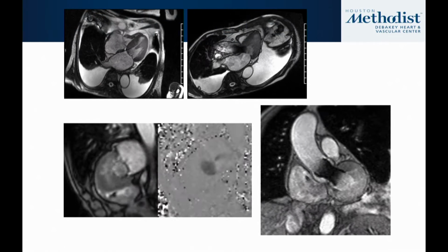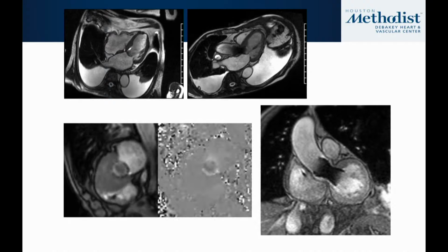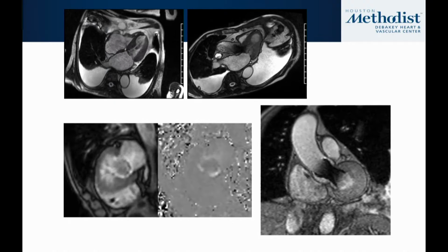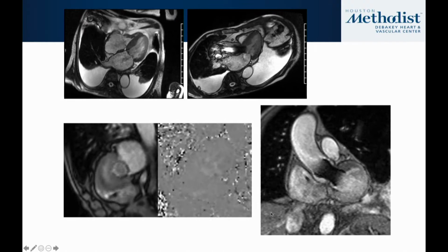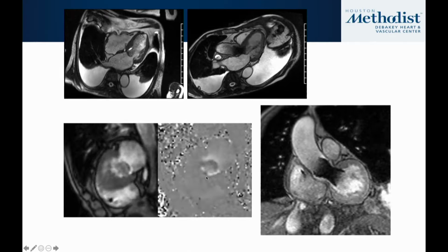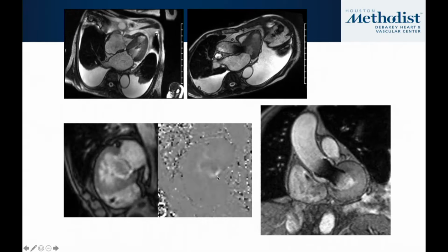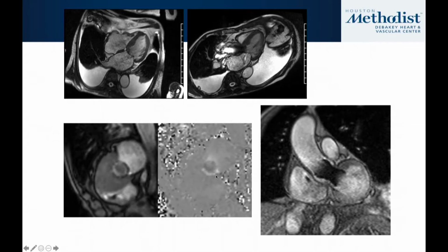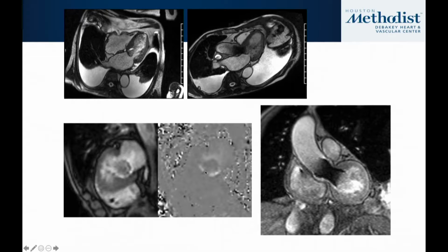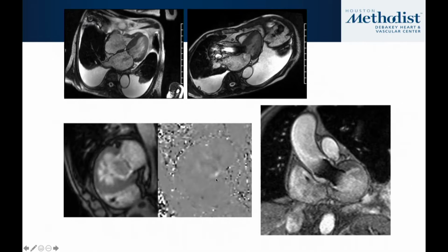Now, in a prosthetic valve, or let's look at even these percutaneous prostheses like a TAVR valve, here's an example of somebody who has paravalvular aortic regurgitation. And you can see very nicely in this view, which is at the left ventricular outflow tract area, a through plane or cross-sectional view, the systolic forward flow, which you'll see in black, and then the diastolic retrograde aortic regurgitation flow, which is in white.